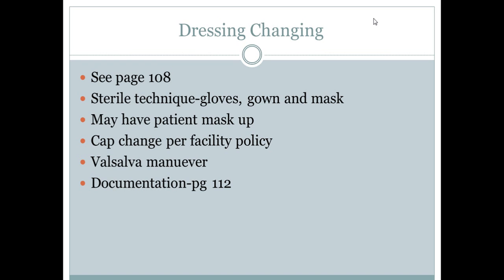Something that I did want to mention on page 113 at the bottom there: special care. Besides doing just the routine care that you're going to be doing for your central lines, it's also important to make sure that you're checking for any damage or kinked catheter, and any fluid leaks you might notice. Always tailor your interventions to meet the special infusion requirements, obviously the pediatric, elderly, and home therapy patients. You will not be dealing with pediatric unless they're over 12. You will not be doing any therapy in the home, so that part can be excluded.